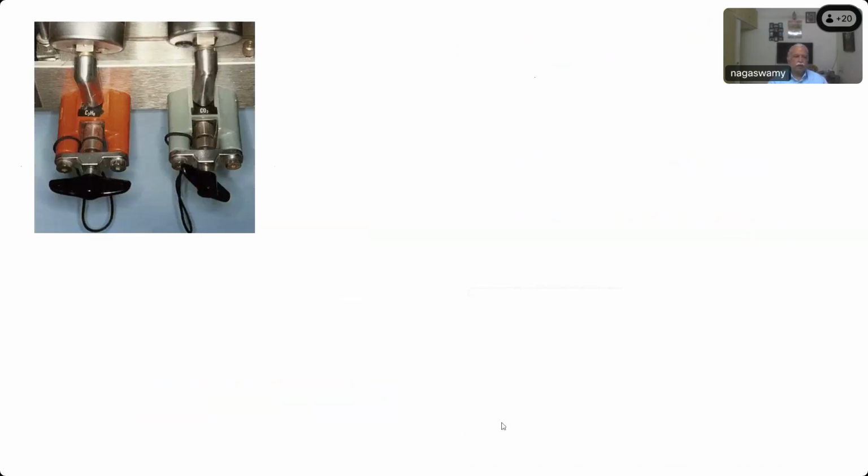What do you see here in this picture? What is this? Is there any cylinder mounted here? Yoke plug. No, sir. So what have they done when there is no cylinder? Is it advisable to leave it open without any cover? No, sir. Close with the yoke assembly. This is called dummy, also known as blanking plug.